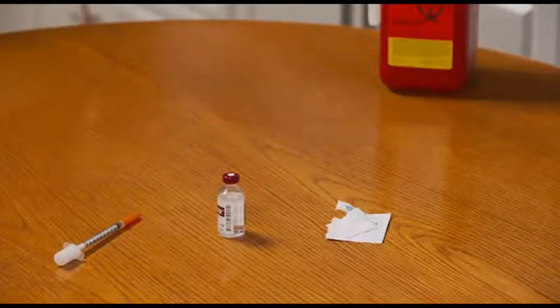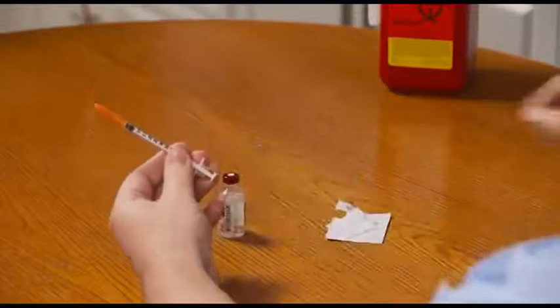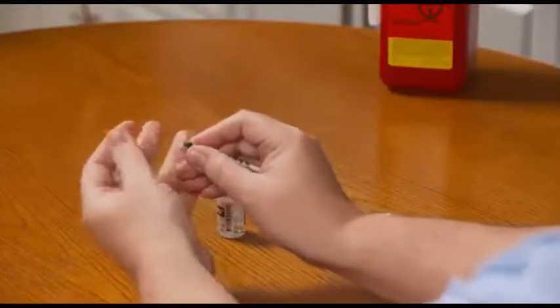To get started, twist and remove the white cap from the end of the plunger. Then, pull the orange cap off the needle, making sure to pull straight off to avoid damaging the needle. In this example, I'm using a dose of 34 units of insulin. So to get 34 units of air into the insulin bottle, first I need to get 34 units of air into the barrel of the syringe.